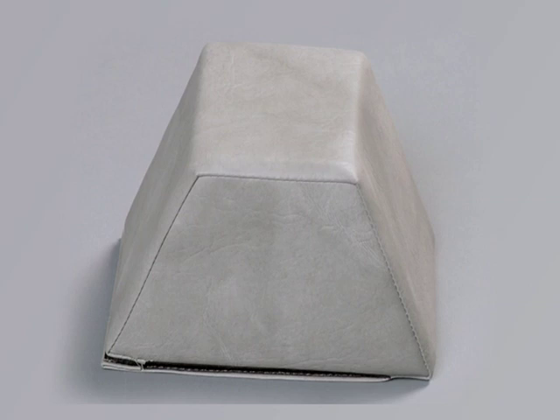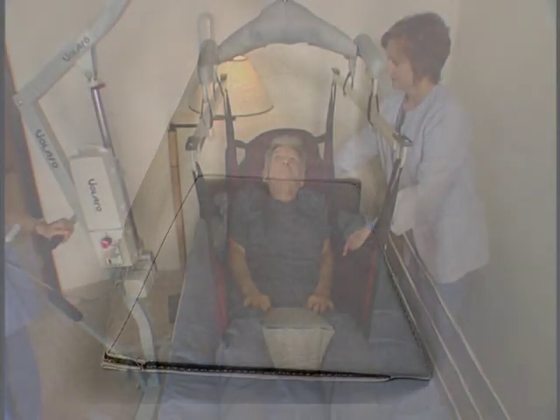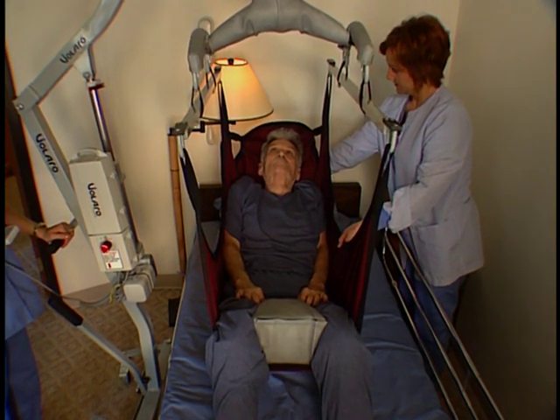Fold the sling and roll the person on the side. Tucking the sling close to the body, make sure the bottom of the sling will rest at knee level. Roll the resident back and pull the rest of the sling through, straightening any wrinkles. You are now ready to transfer.